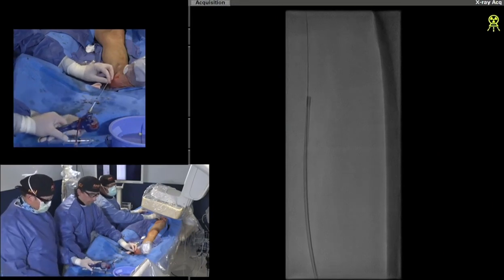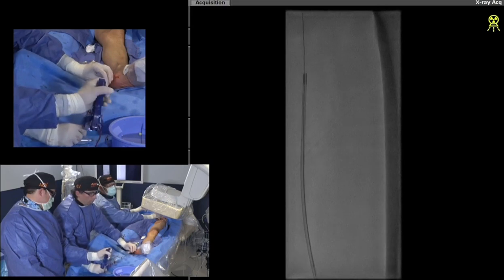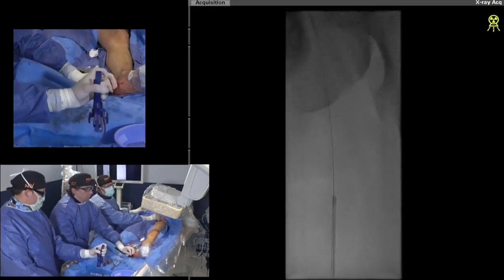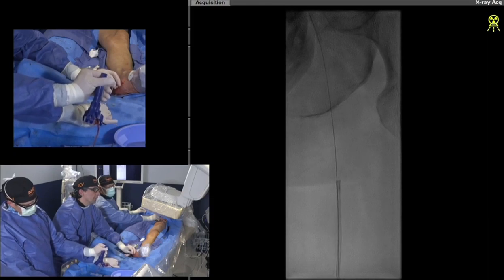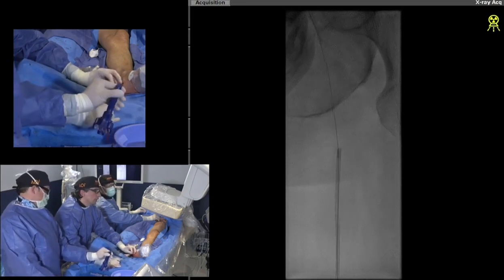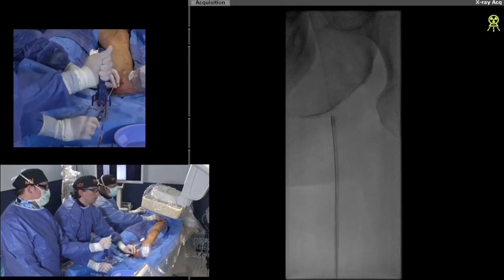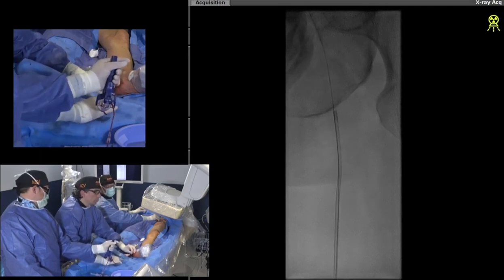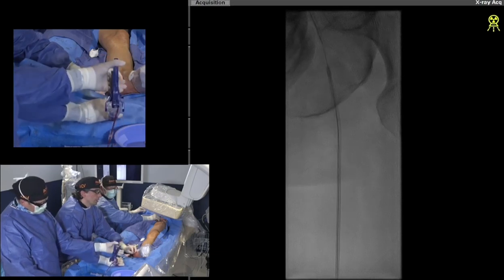Is there a reason you're doing thrombectomy from below retrograde versus antegrade? I'm going to treat this patient completely via an assisted TAMI approach — doing everything from below: thrombectomy, laser atherectomy, and balloon angioplasty via pedal approach. I like this because you still have the occlusion above, so there's stagnant flow — you're not fighting stuff going downstream with a retrograde approach. It's pretty intuitive and logical.